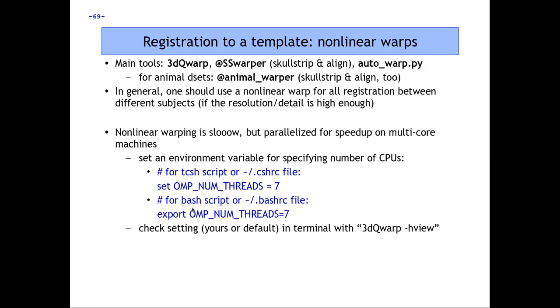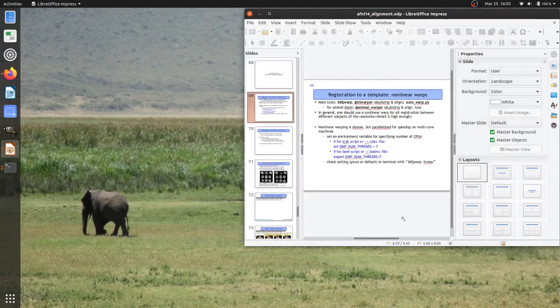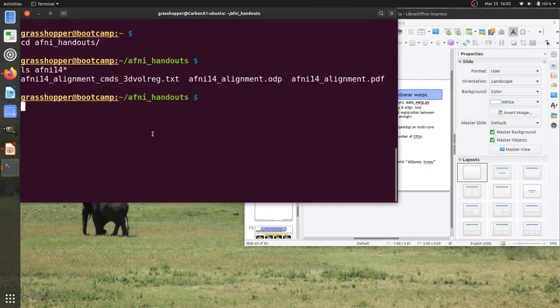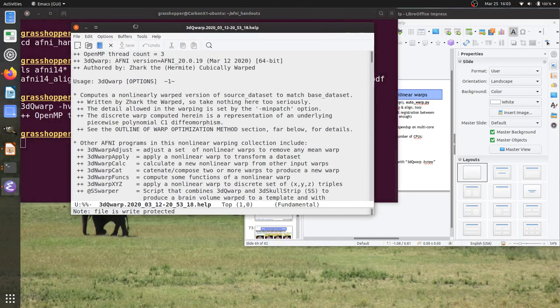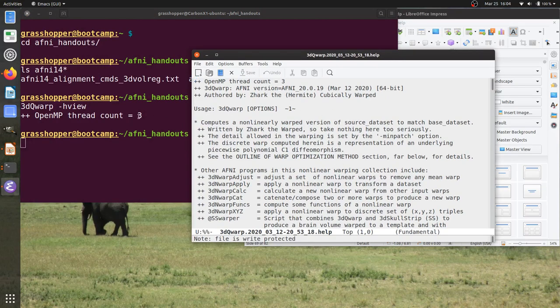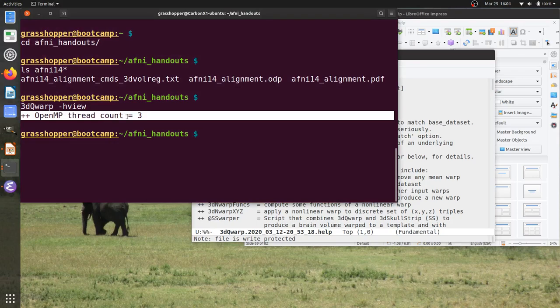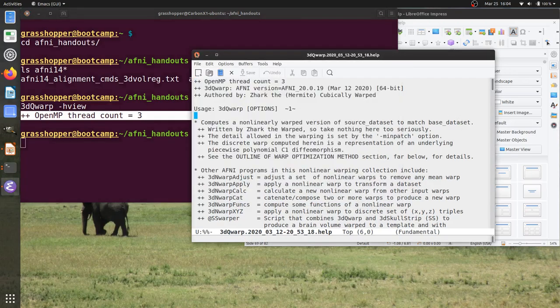If you want to see what your thread value is set to, an easy way is to run 3dQwarp -hview. Here in my terminal I'll type 3dQwarp -hview. The -hview option opens the help in a separate text editor, but you also see useful information in the terminal — the OMP thread count is three. In this case I'm on my laptop which only has four cores, so three is reasonable. Anywhere up to 16 or higher — I've used 32 on the Biowulf at NIH — can increase efficiency and decrease processing time.